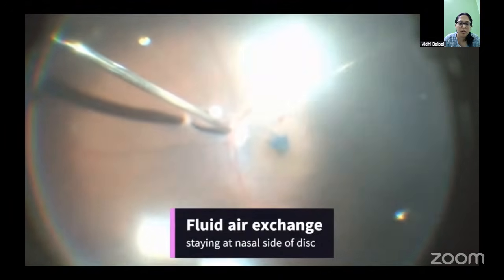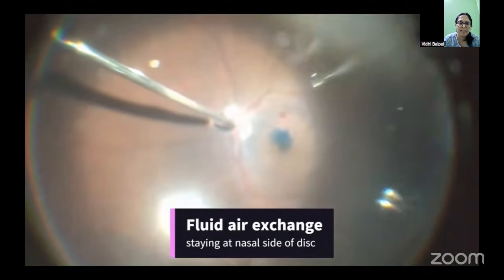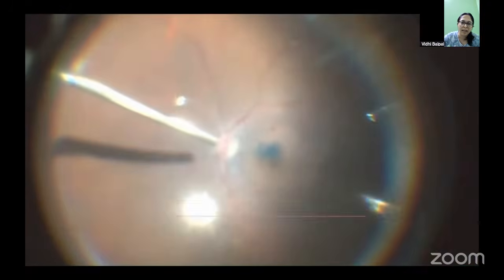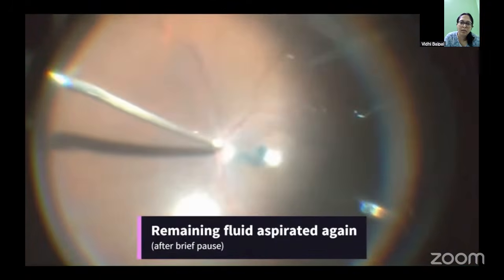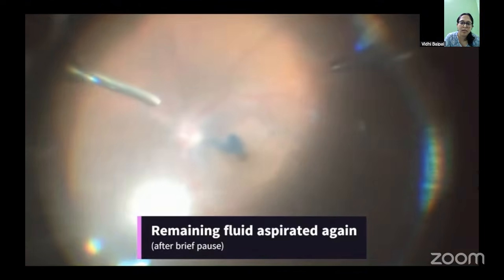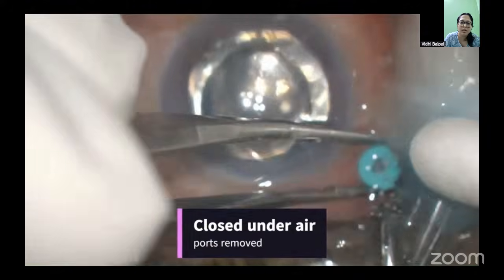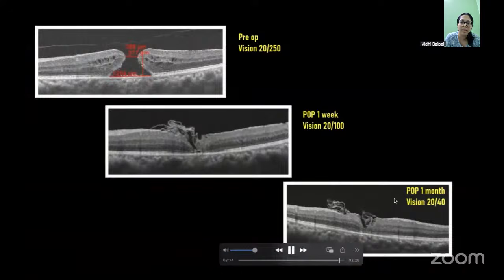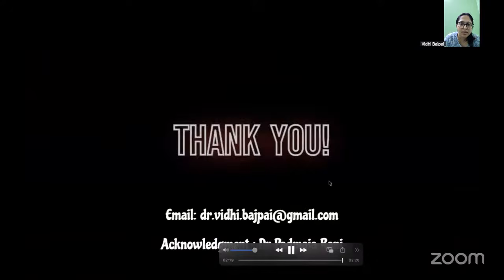So then I do a complete fluid air exchange while staying at the nasal side of the disc. As you can see in the video also, the flaps sort of lay across the macular hole when I'm doing this fluid air exchange. I'm not really bothered about positioning the flaps or touching the flaps at any matter. And I wait for 30 seconds and then do another round of fluid air exchange, and then I close under air. So this is the case where the hole achieved type 1 closure and the patient gained 20/40 vision.